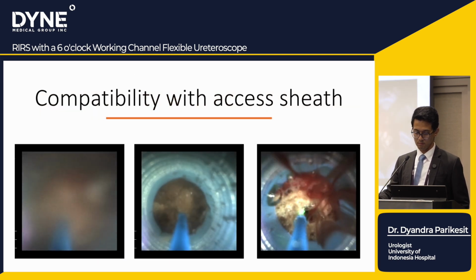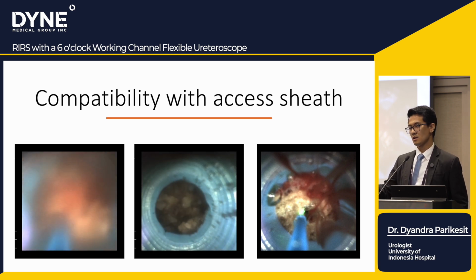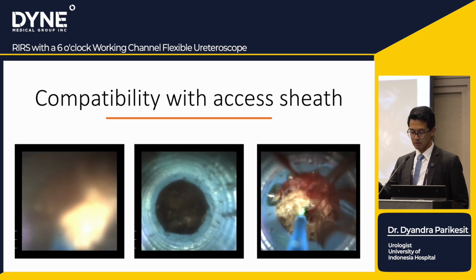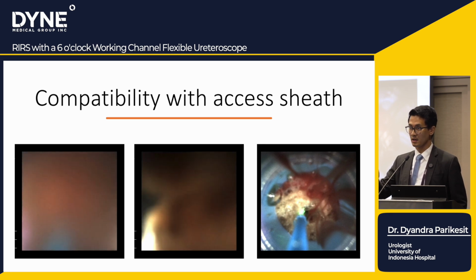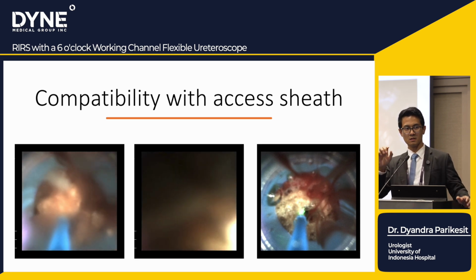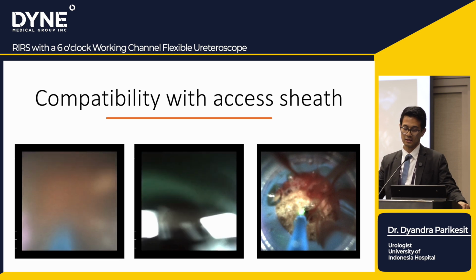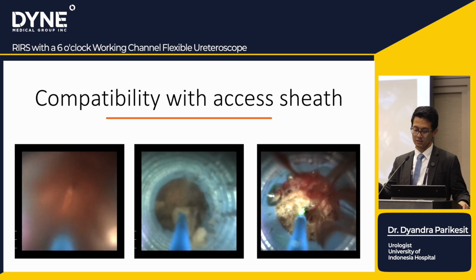Also with the access sheath, usually if you're using suction and have the laser at 3 or 9 o'clock, you're not actually able to measure the distance between the tip of the laser and the outermost part of the access sheath, right? So sometimes you get damage to the access sheath.